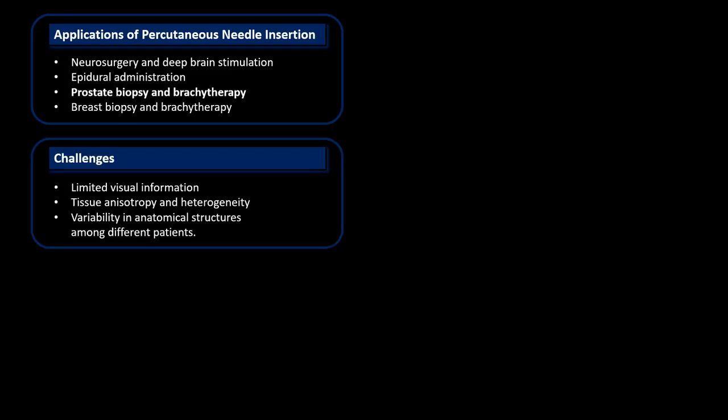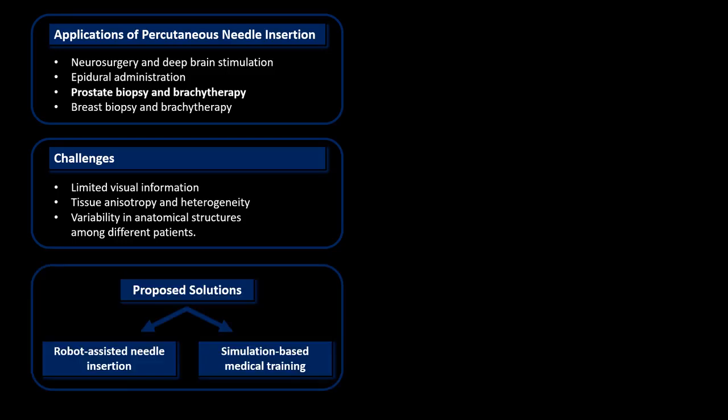At the same time, accurate percutaneous needle placement is a highly challenging task due to various factors such as the limited visual feedback during the operation, the tissue anisotropy, and the variability in anatomical structures among different patients. To increase the accuracy of needle placement, different solutions have been proposed in the literature, such as the development of robot-assisted needle insertion systems and virtual simulators for medical training and preoperative planning.